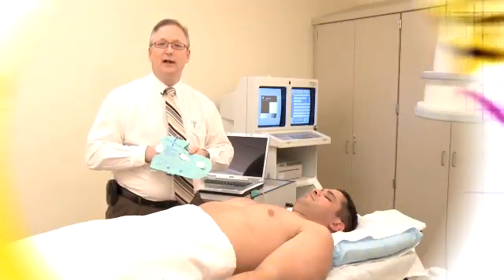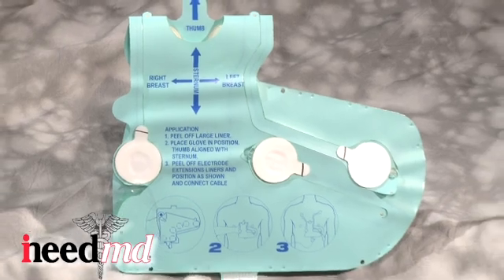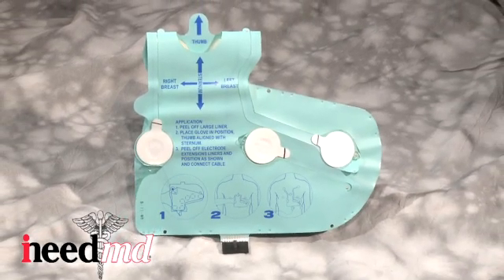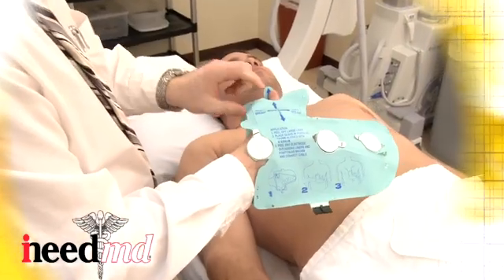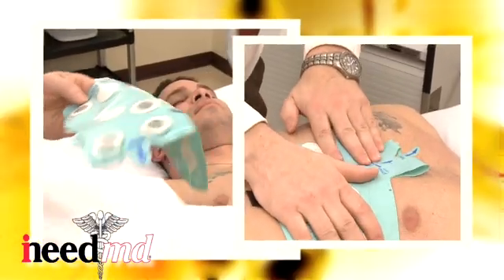This short instructional video will guide you through the steps of applying the iNeedMD ECG 12-lead glove to the patient. One of the main benefits of this patented glove is the easy application process.